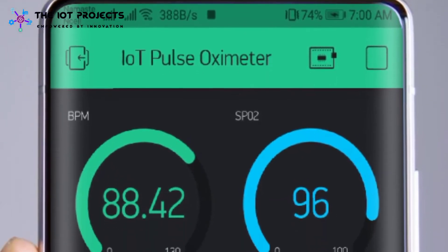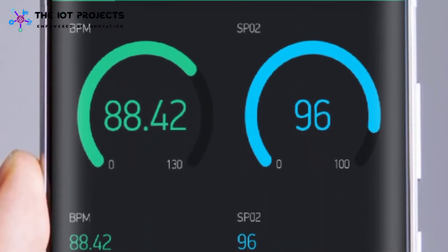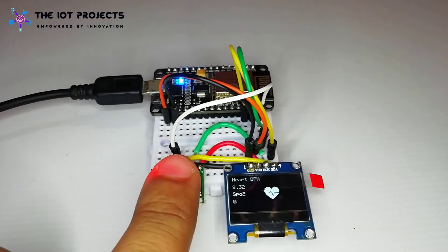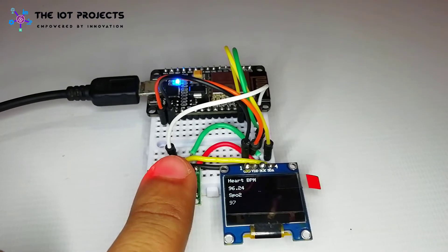In this project, you will learn to make an IoT-based pulse oximeter using NodeMCU ESP8266 module, MAX30100 oximeter sensor, and the Blynk application.